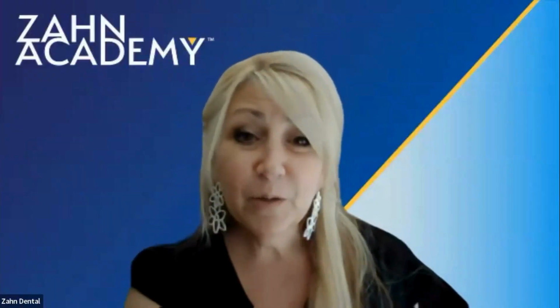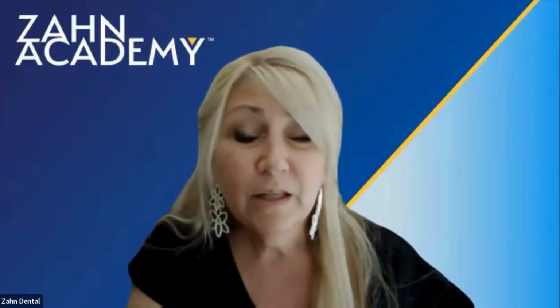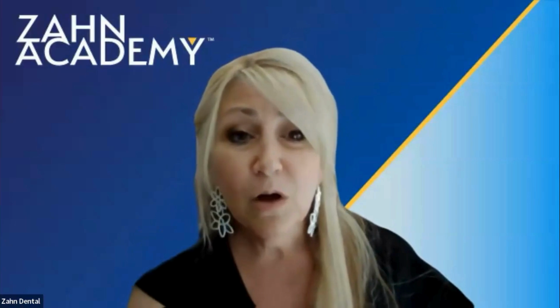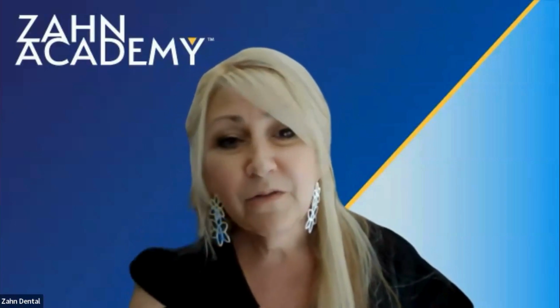Today, I have with me Phil Marianacci, who's the owner of 360 Digilab, and he's going to be discussing with us the virtual collaboration between the dental clinic and the dental laboratory, featuring the software Nemostudio, brought to you by Nemotec. And so, today, Phil has decided to bring us some poll questions that we're going to be launching right now. So if you wouldn't mind, when I put them up, to please answer.